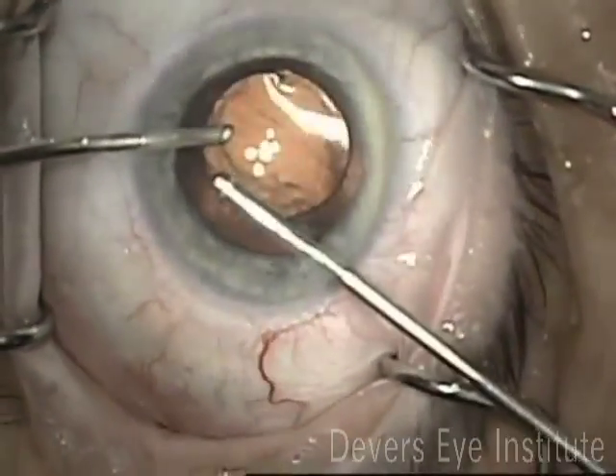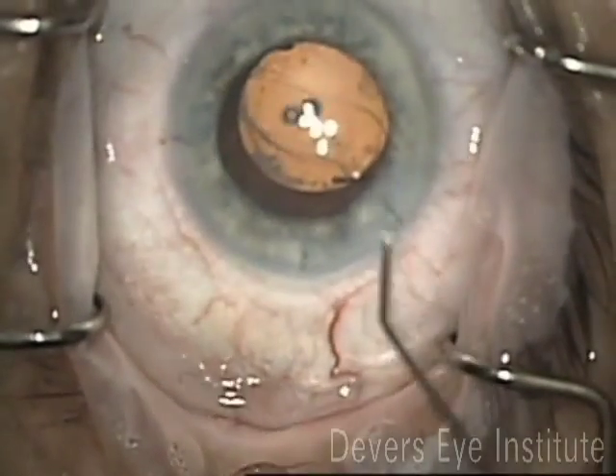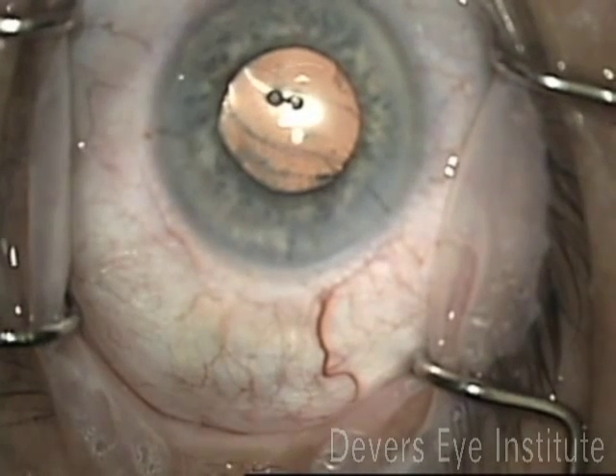Here's a sped-up clip where I'm just thoroughly removing all the viscoelastic. The wounds are sutured tight, Miochol is introduced, the pupil comes down nicely, and that's the end of the case.